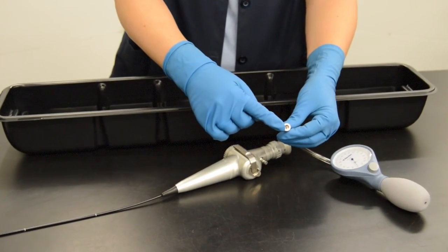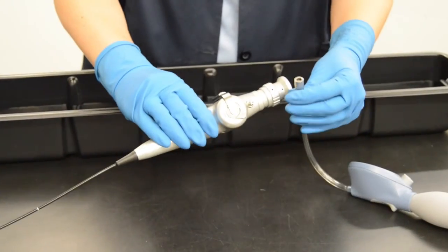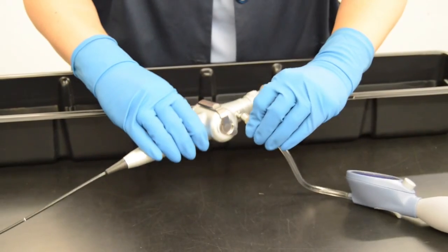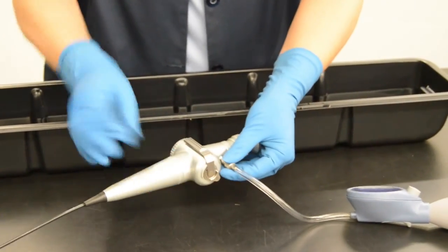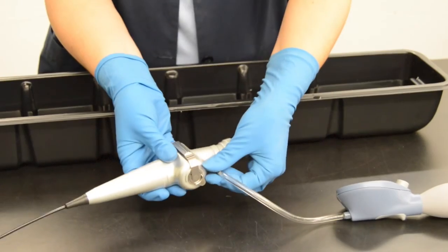Connect the leak tester to the vent by aligning the pin in the leak tester connector with the groove on the vent, pushing down and rotating the leak tester connector clockwise one-quarter turn.